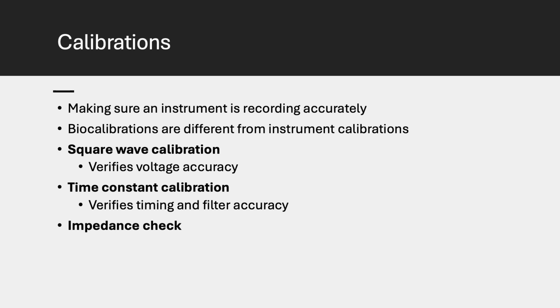Many systems will produce a channel by channel scroll of a square wave which will trace a DC 50 microvolt per centimeter on and off signal, meaning every second when the DC is on, the signal jumps and stays at 50 microvolts. When the DC signal is off, the tracing falls down to the electrical baseline or zero.